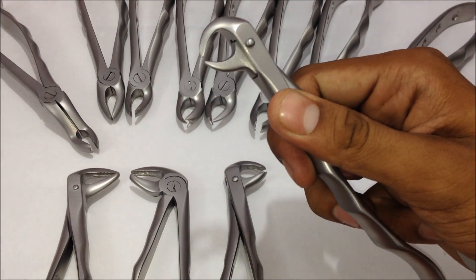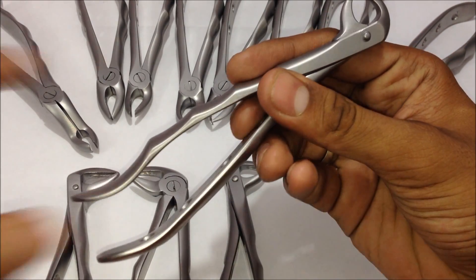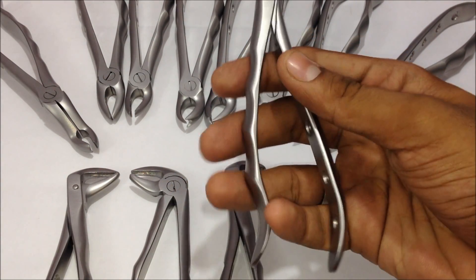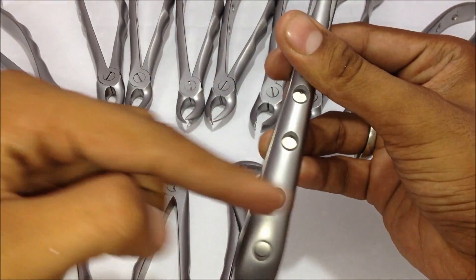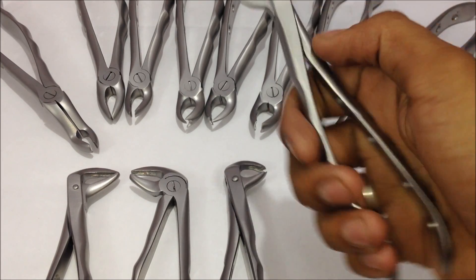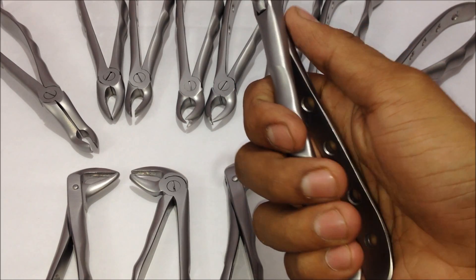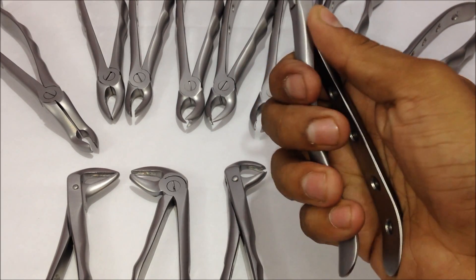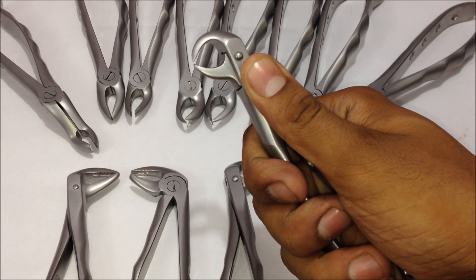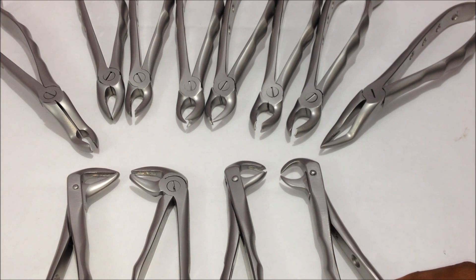The hinge area needs proper care while sterilizing your extraction forceps. The handle area has two handles and comes in different varieties — a few come with serrations or lines, and some come with holes for grip while using hand gloves. These are the depression areas where you can place your fingers for a proper grip on the extraction forceps. This is a complete kit of the forceps.